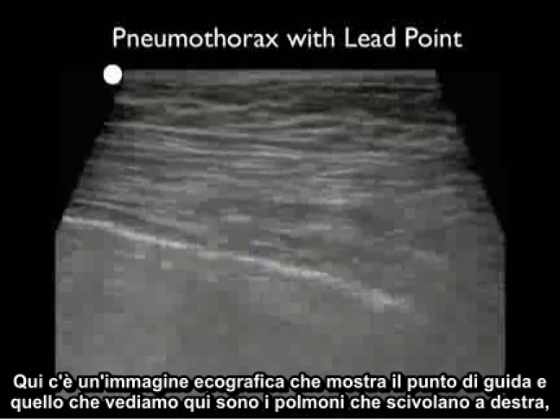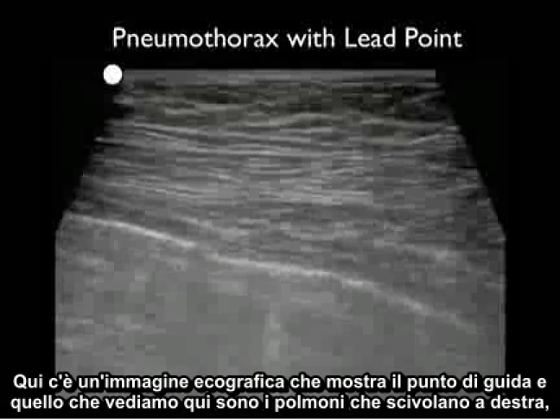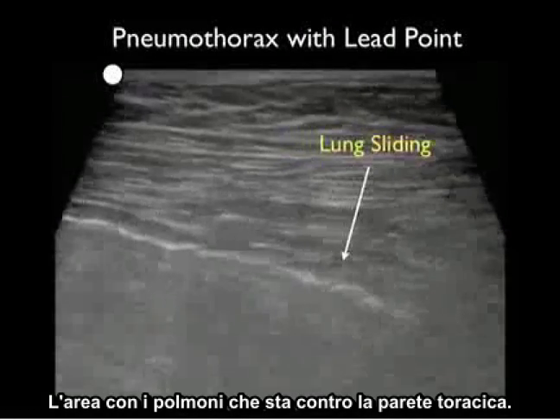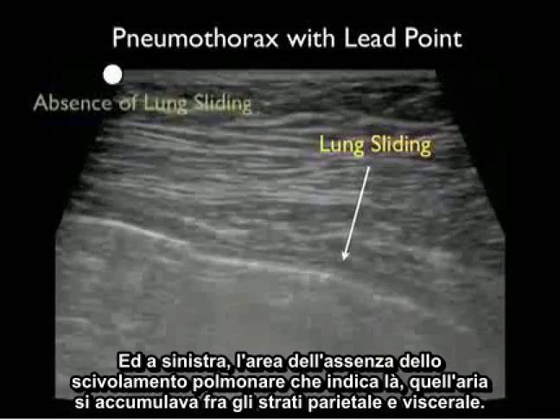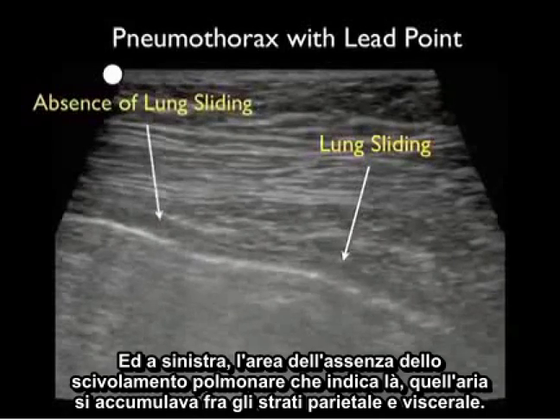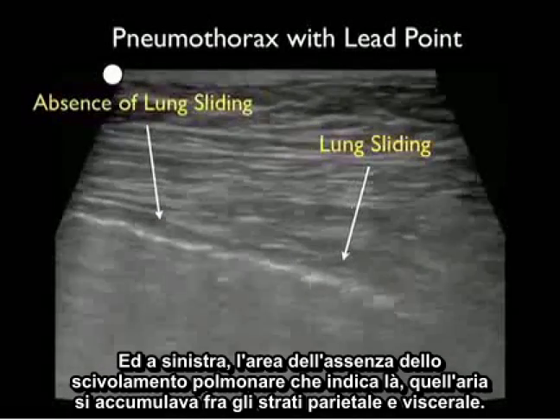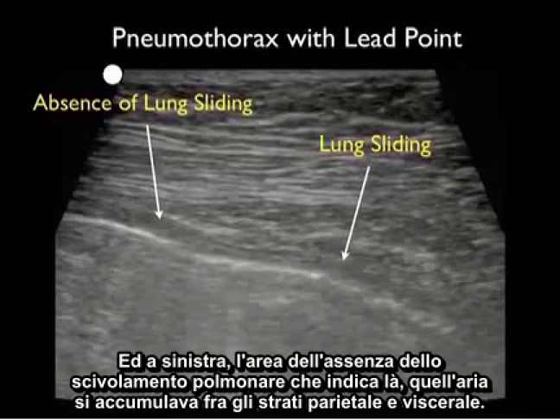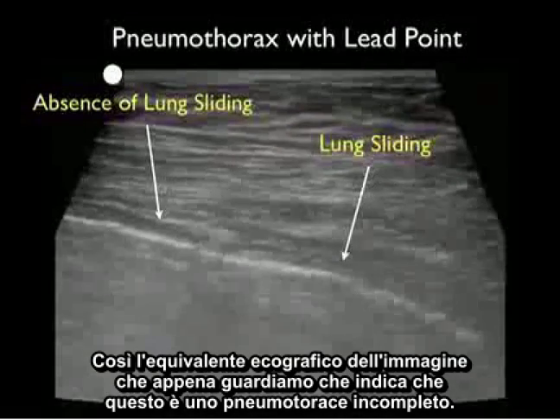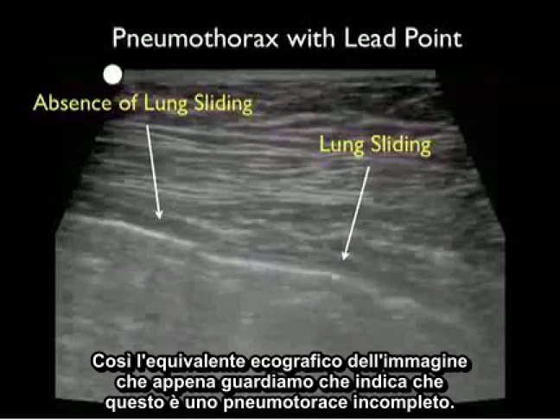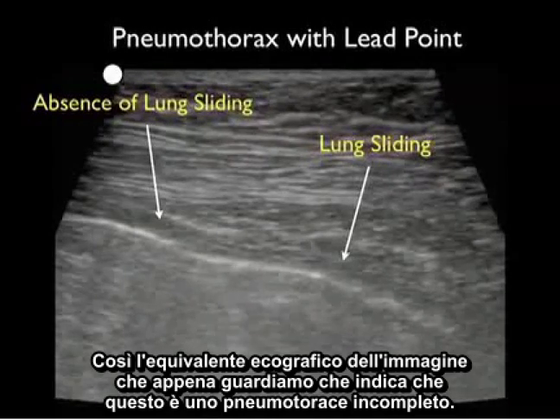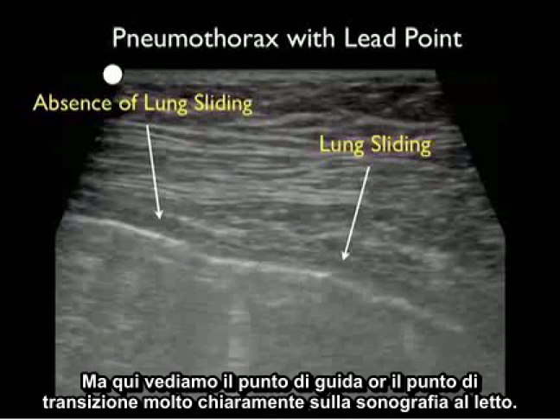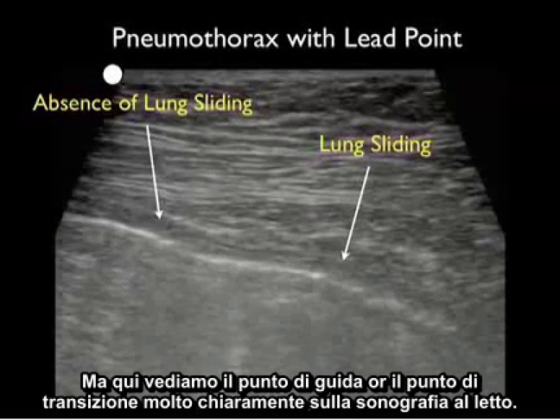Here's an ultrasound image showing the lead point. We see the lung sliding to the right — the area where the lung touches up against the chest wall — and to the left, the area of absence of lung sliding, telling you that air has collected between the visceral and parietal layers. This is the ultrasound equivalent telling you that this is an incomplete pneumothorax, and here we see that lead point, or transition point, very well on bedside sonography.